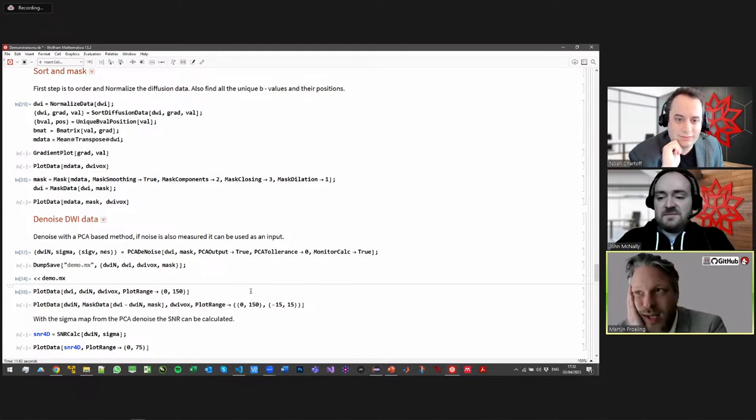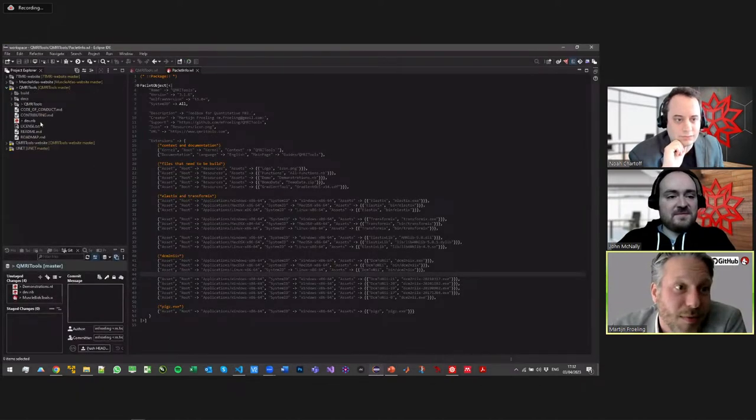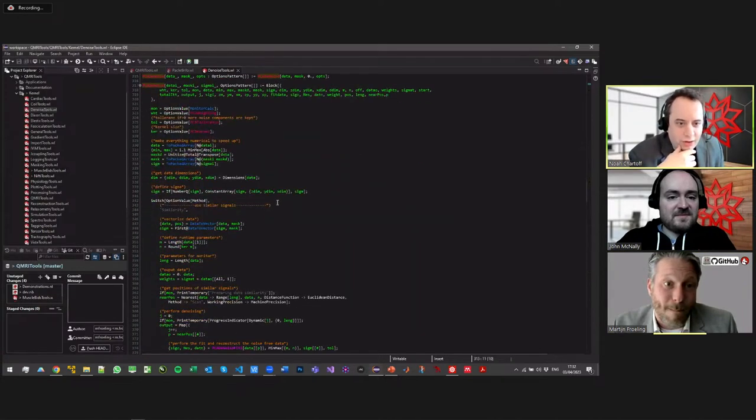And actually for this, I think I just use the default. Well, we can actually look at it. I have no clue what kind of function I'm actually looking at. So when I do development, I use Eclipse. So this is, I know, in denoising tools, and it's called PCA denoising. It's quite hard to read a lot of these.